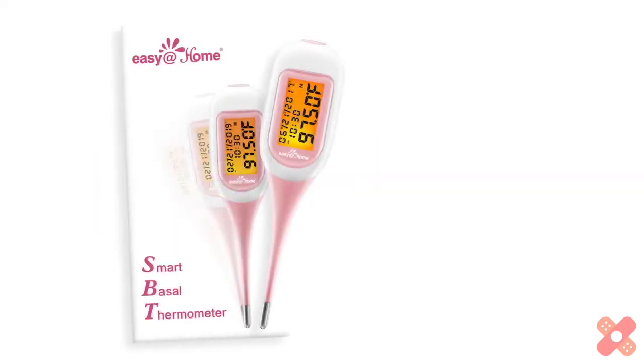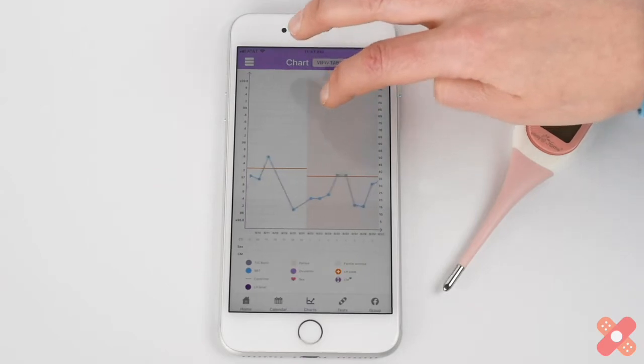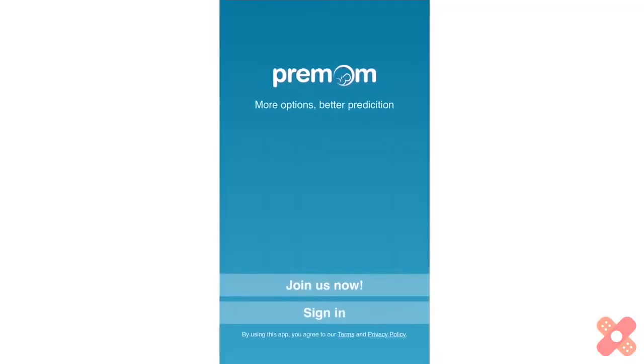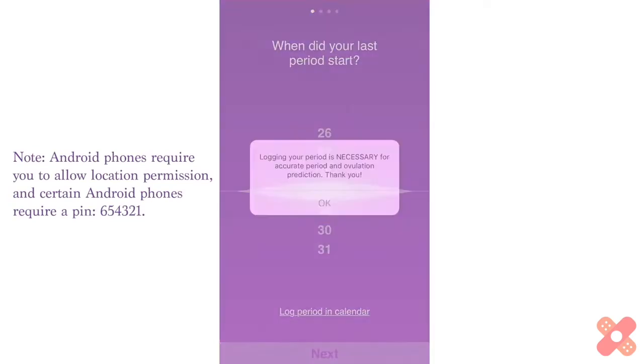Congratulations on your new BBT thermometer! Normally charting and tracking your temps isn't easy, but Premom makes it easy for you with the Easy at Home smart thermometer and the companion Premom app. In just a few seconds you can easily sign up for Premom from the Apple or Google Play store for free.